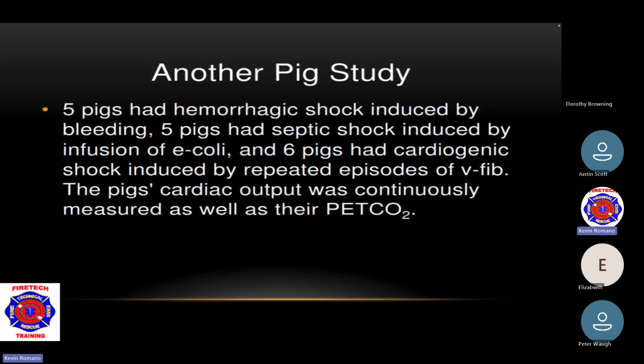Here's another pig study for you. 5 pigs had hemorrhagic shock induced by bleeding. 5 pigs had septic shock induced by infusion of E. coli, and 6 pigs had cardiogenic shock induced by repeated episodes of VFib. The pig's cardiac output was continuously measured as well as their PETCO2.